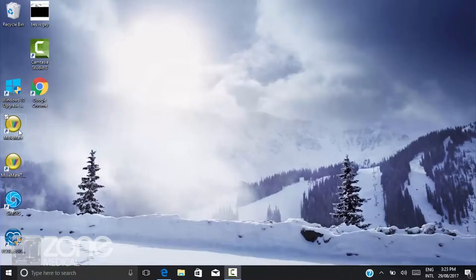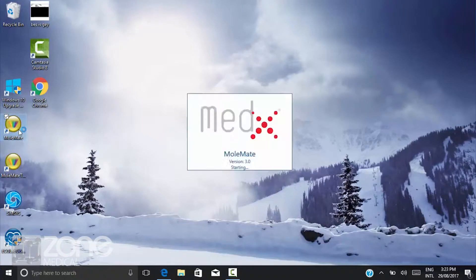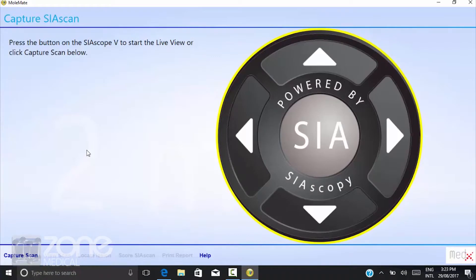Once you've installed the software, simply double-click on the icon to initiate. Once the main screen comes up, you'll be prompted to capture a scan. Do this by clicking the capture scan button.